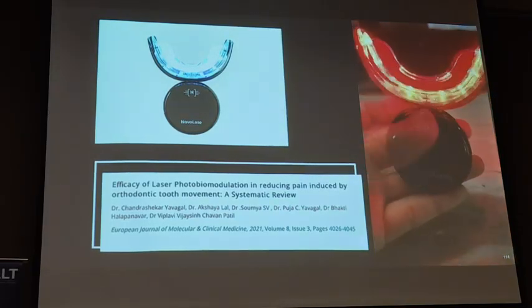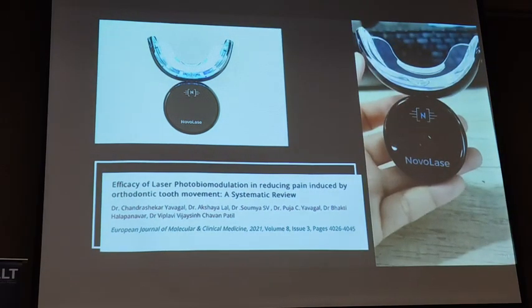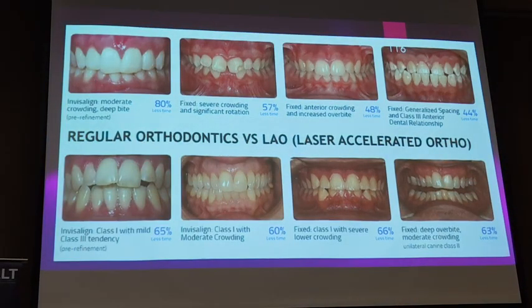You can search PubMed, type light accelerated orthodontics, and you will find n number of articles regarding the influence of light in orthodontics. You can reduce so much time in treating such cases. See here, Invisalign model, they have reduced the time by 80% using the light. Here 57% reduced the time, 48%.